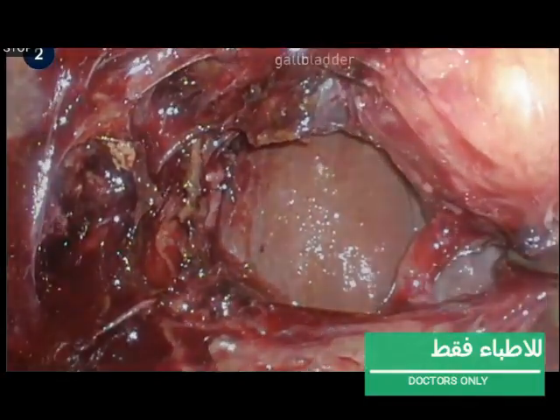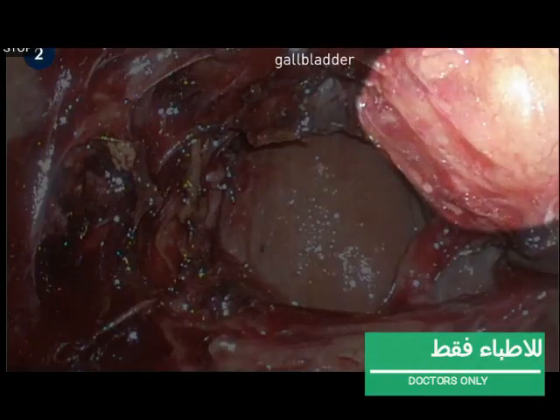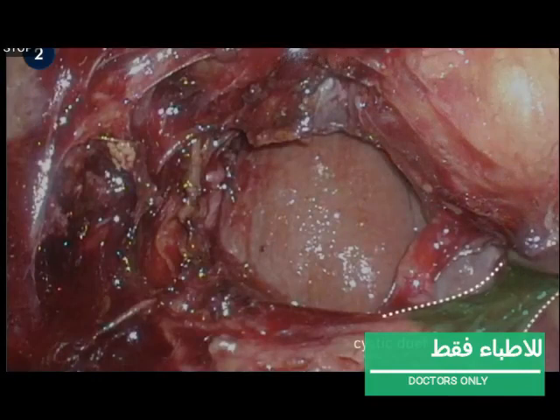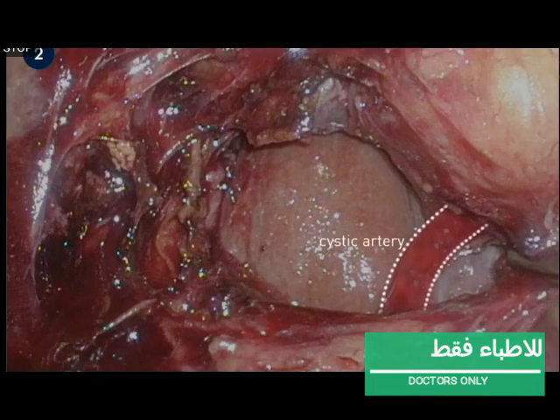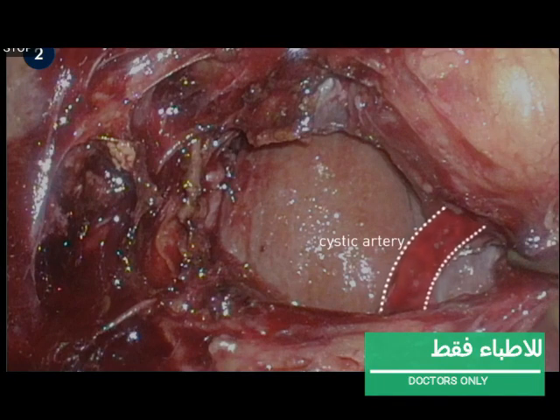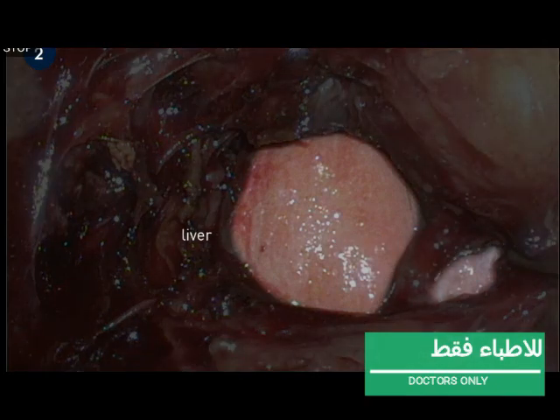After turning to the other side, you can see the gallbladder, the cystic duct, the cystic artery, and the liver bed in the background, with no other structures in between.